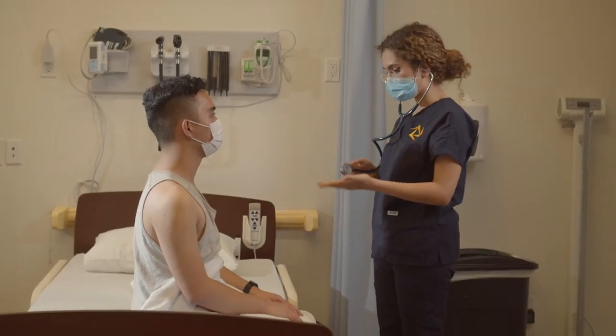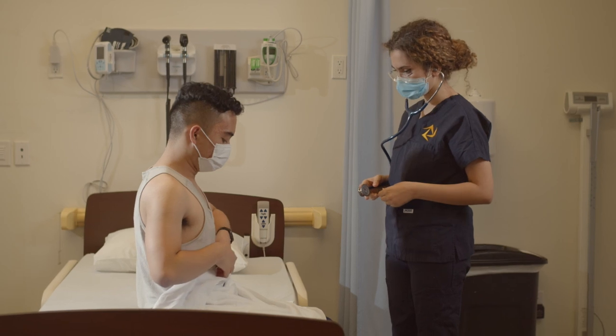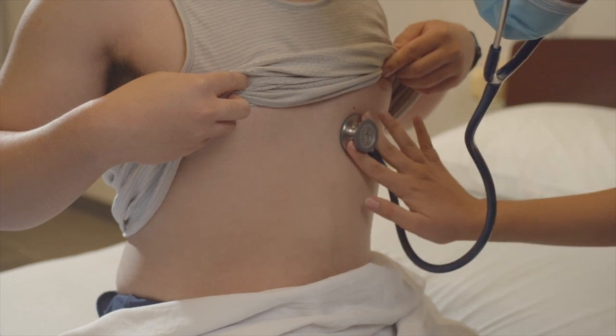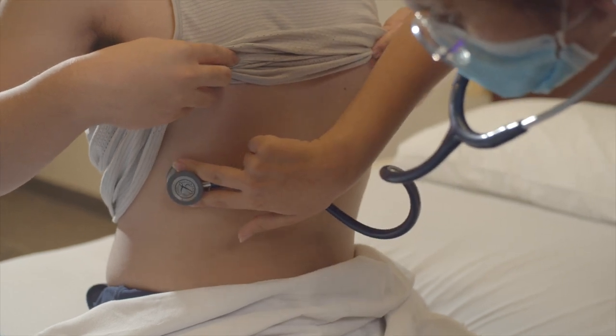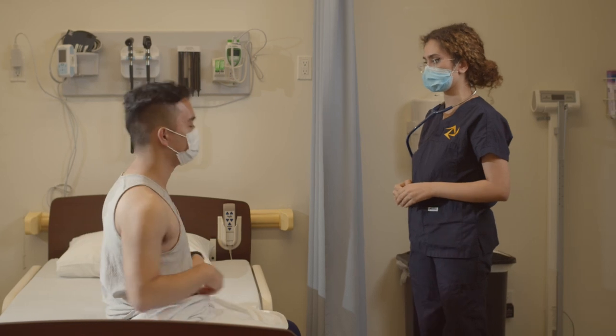Now you can keep the drape on your lower half, but can you pull your tank top up at the bottom so I can listen to the lower half? Okay, we can pull your tank top back down and you can breathe normal again.